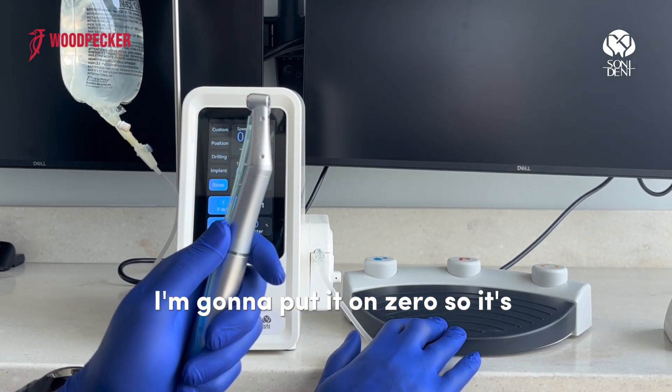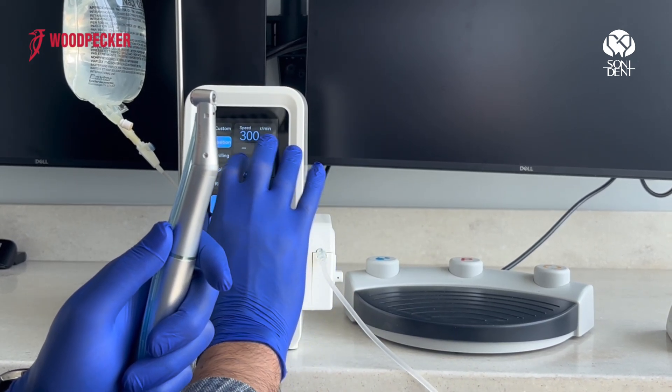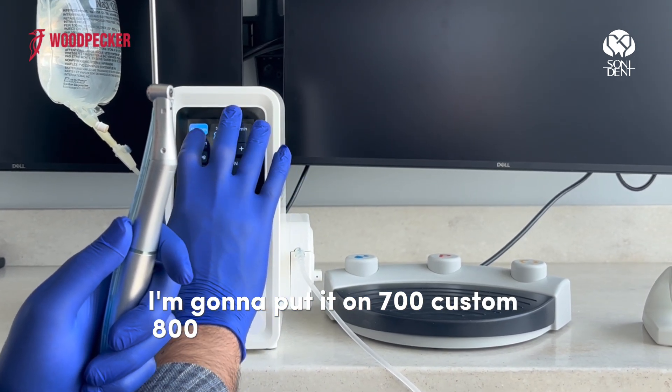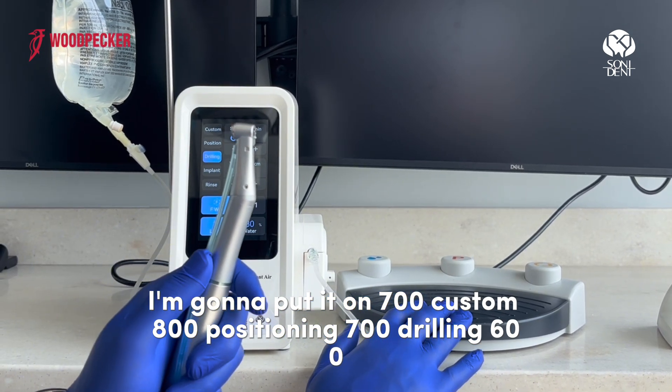I'm going to put the water on zero, so it's not dispensing any water right now. Custom is at 800, positioning at 700, drilling at 600.